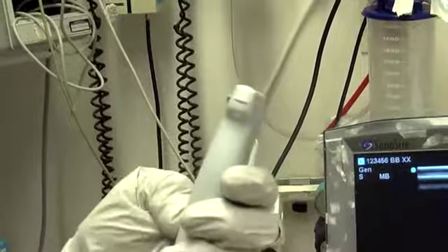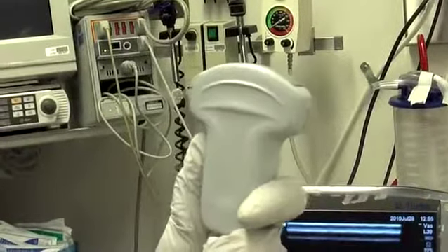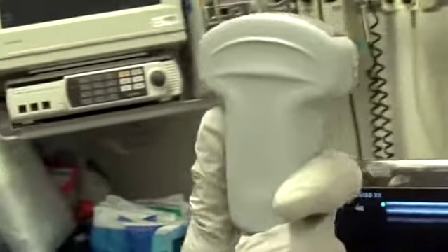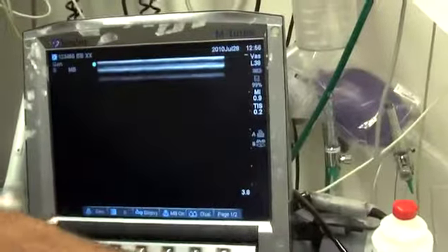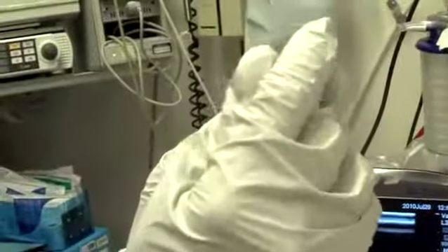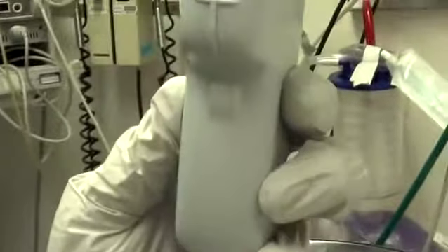Another workhorse probe is this curved array. This is good for abdominal. It penetrates well. It'll give you good resolution when body habitus is challenging. And the marker on that probe? The probe marker is this divot. Actually, I'm sorry. Yeah, it's this divot. It's that notch thing right there. Yes, a mistake commonly made. I'm glad you made it for us all.